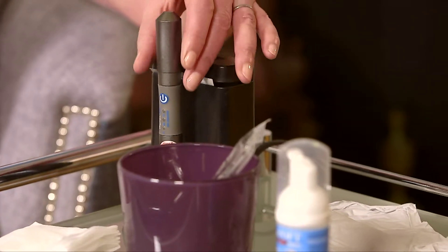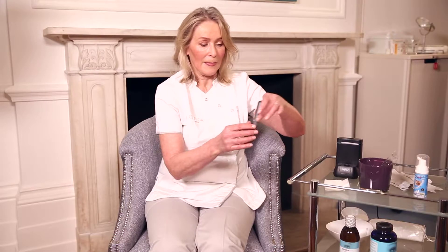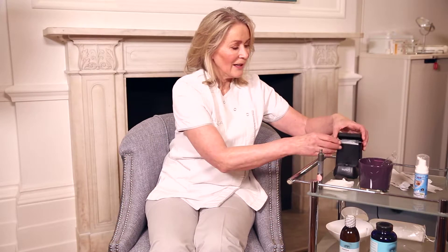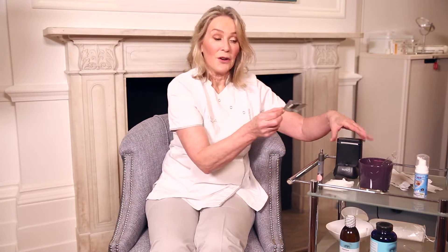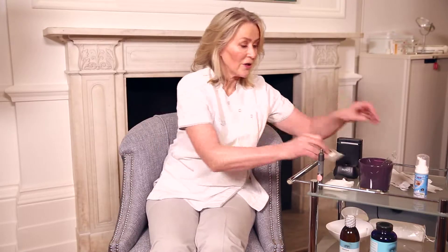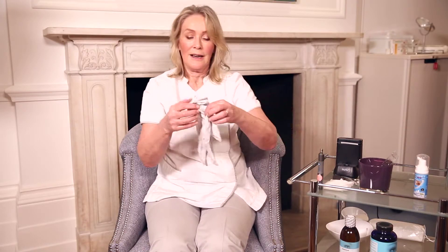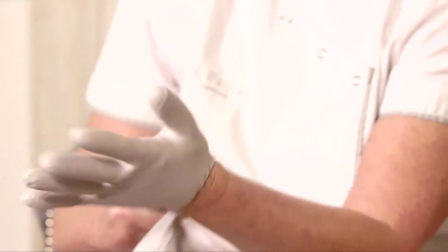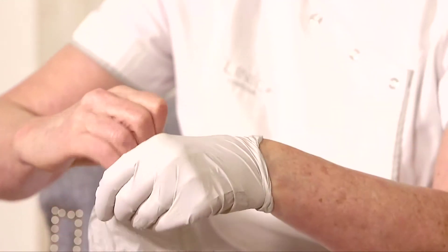I need to show you the machine. There's a little sponge - four sponges, one for each eyelid. I haven't got my gloves on, so I'm just going to pop those on. In real life with a patient, I would have already washed my hands and got my gloves on to get ready.